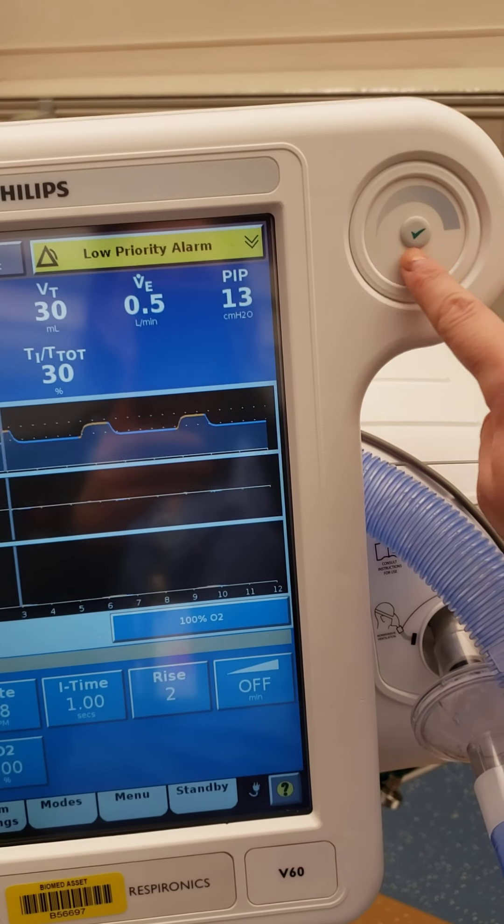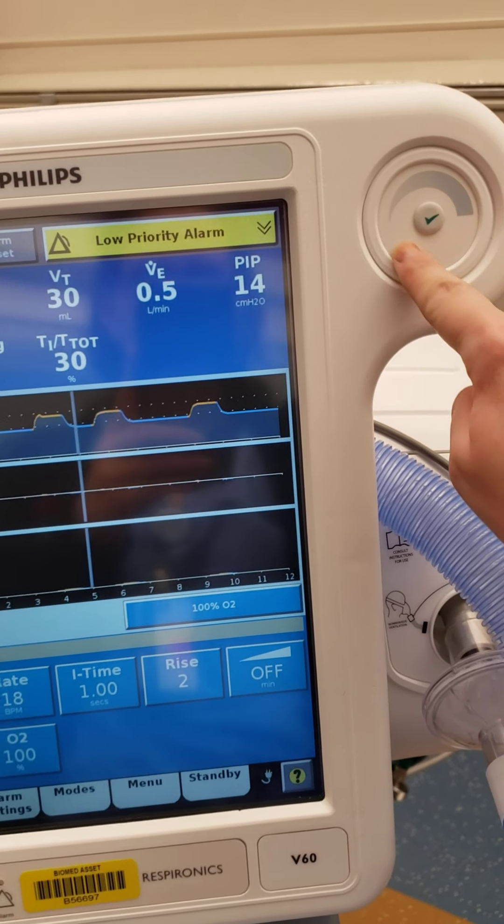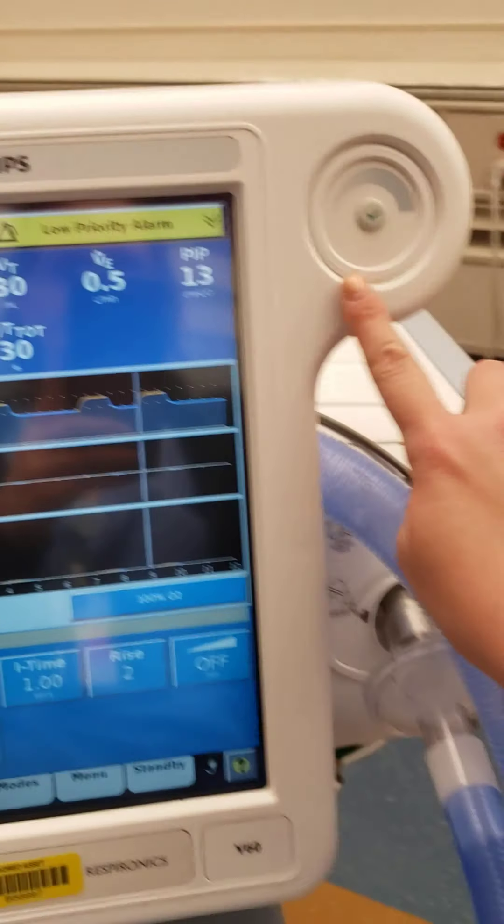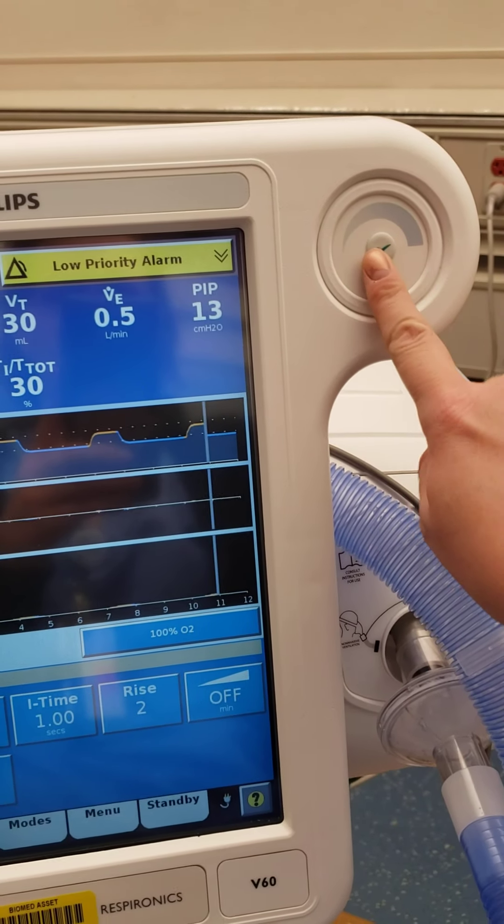Another feature is this touch dial, so you can use this to make setting changes after selecting, and then use the green button to actually select.